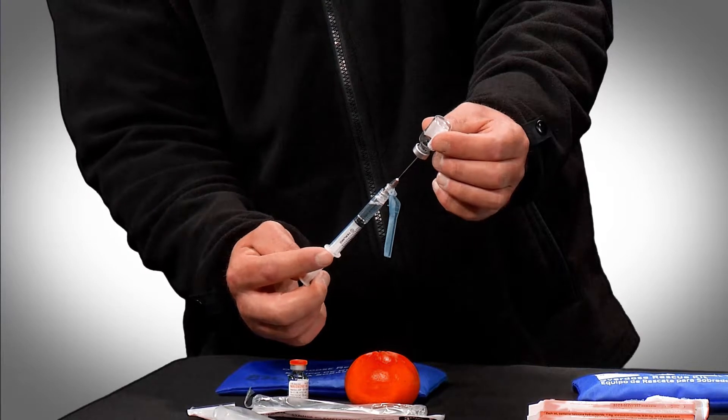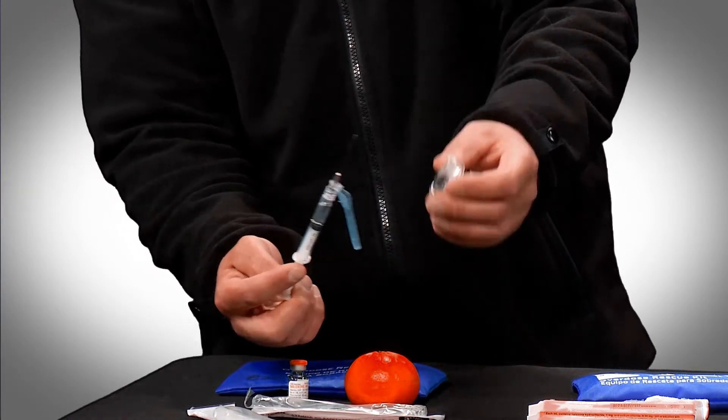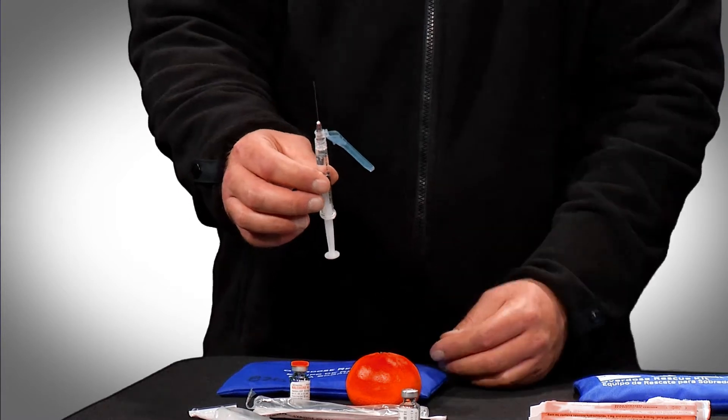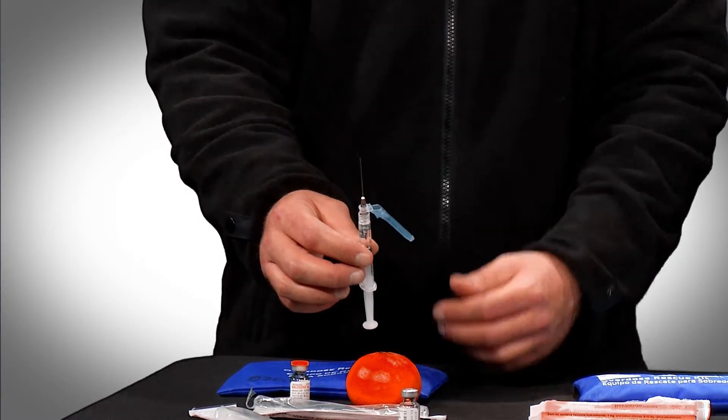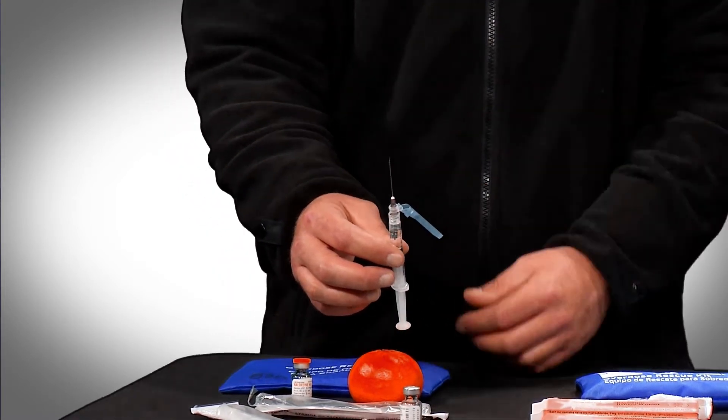Since this is an intramuscular injection, it's not going to matter if there's air in the syringe. This injection is going to go into a person's shoulder or the front of their thigh.